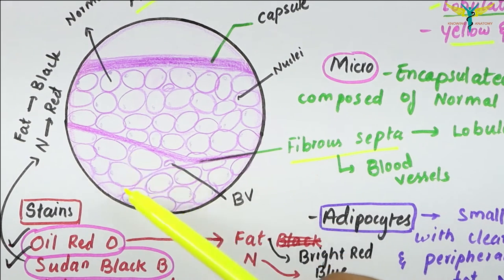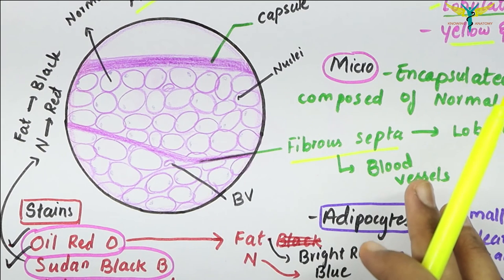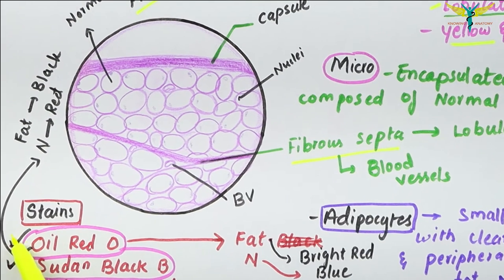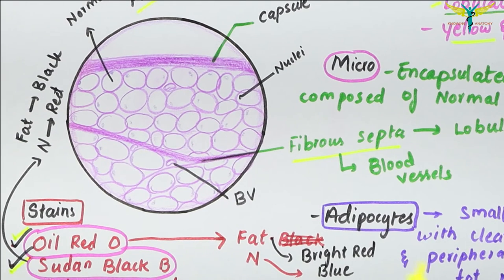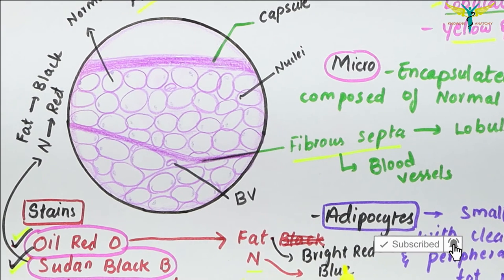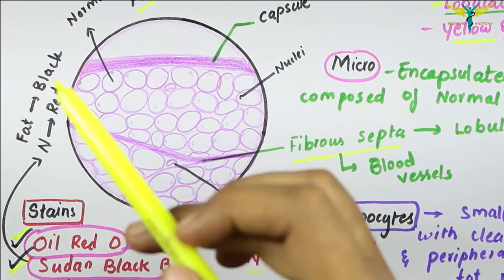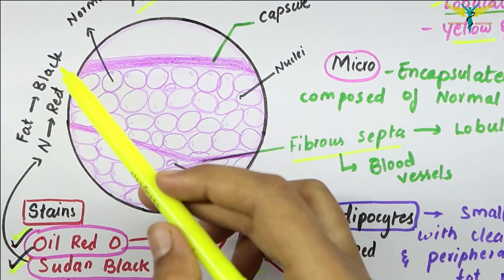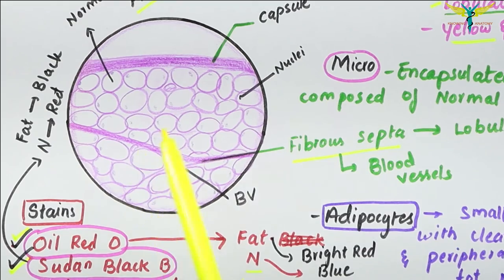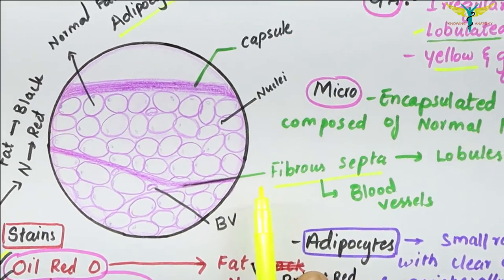The adipocytes are small round cells with clear cytoplasm and the nucleus pushed towards the periphery. The stains used for lipoma are Oil Red O and Sudan Black B. Oil Red O stains the fat bright red and the nucleus blue, whereas Sudan Black B stains the fat black and the nucleus red.